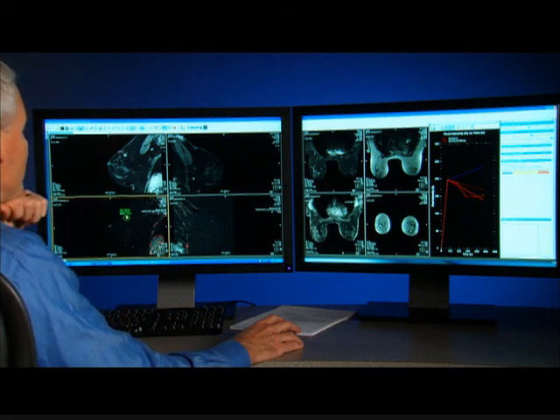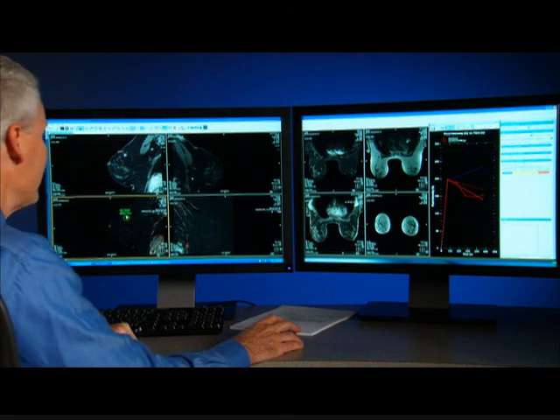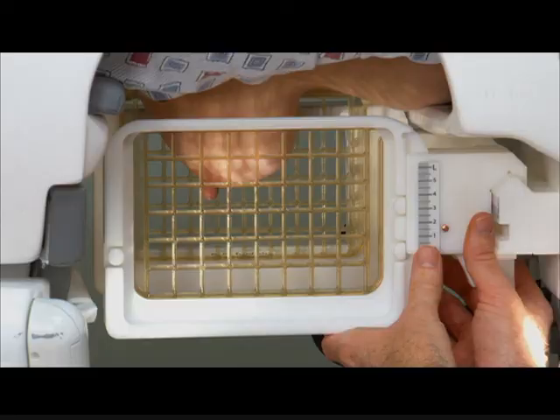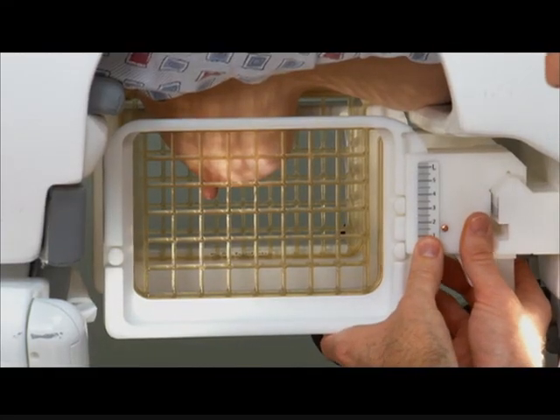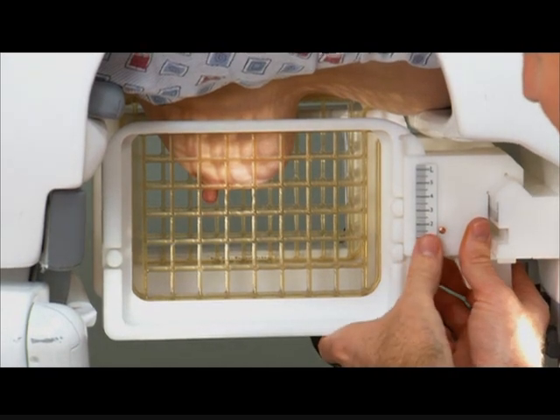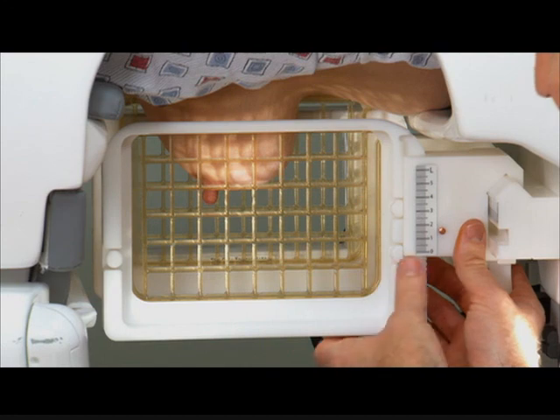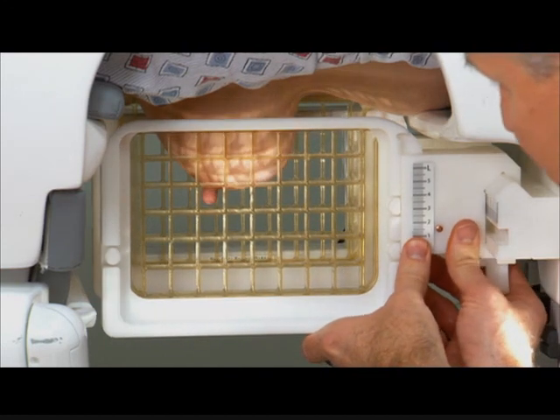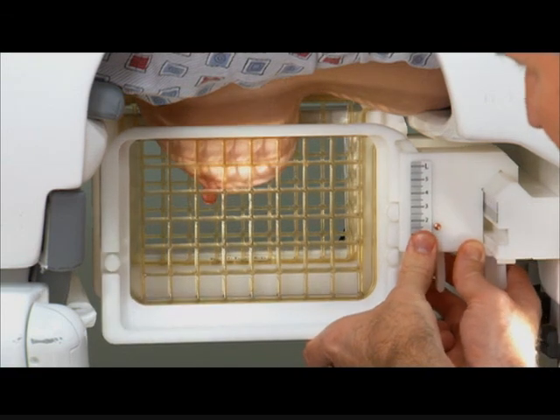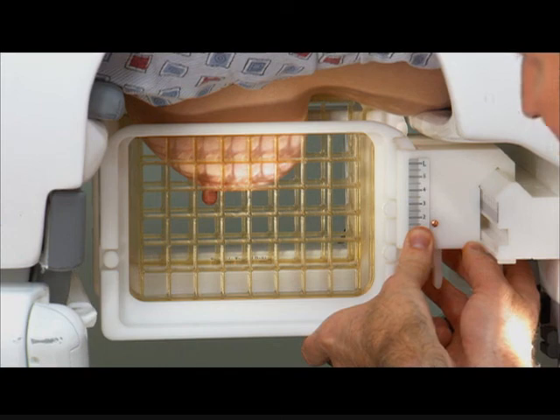Additionally, what I would do in this case is follow this to biopsy, and demonstrate quickly our approach to biopsy. I think one of the things initially very important in performing breast MRI biopsy is to position the patient correctly. My personal bias is this is not something that the technologist should do. In our institution, the technologists get the patient in place and lying on the table, but then I always position the grids as well as the breast tissue.